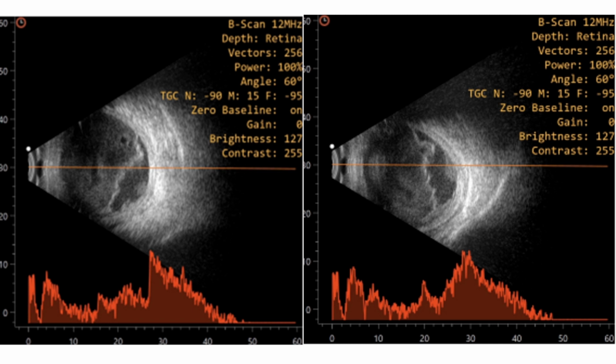Okay, but why was it not mobile? So maybe the exudates were organized, giving the appearance of a membranous echo, and the vitreous cavity is full of clump echoes as well. Maybe the movement was less. Yeah, but still a vitreous membrane would be mobile, right? Yes, sir. Suppose that's the posterior hyaloid, that should be mobile. Yes, sir. No, you told it is not mobile. If it was not mobile, I would think it more of retinal.